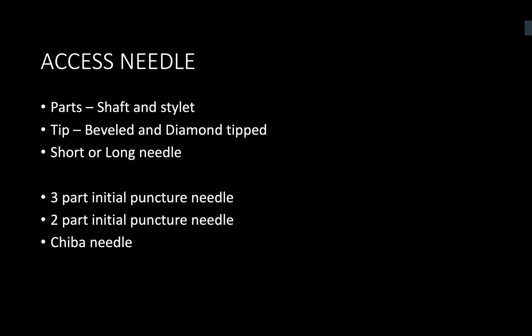I know it is not commonly used nowadays, the PCNL, except for complete Staghorn or even for a partial Staghorn calculus, which is rare nowadays. Mostly we are using ureteroscopes, isn't it? But for the teaching purpose, especially if there is a question on PCNL, we will be expected to answer questions on that.